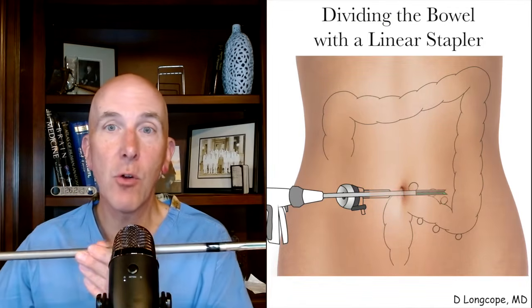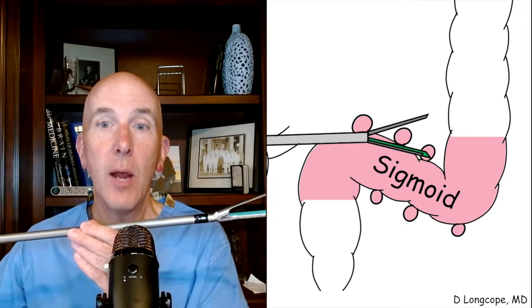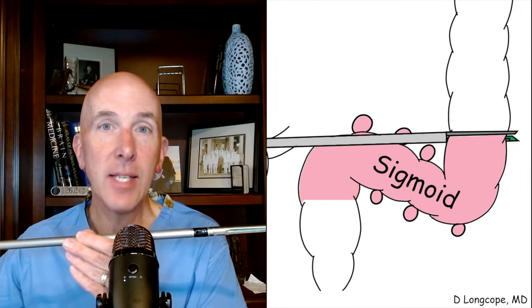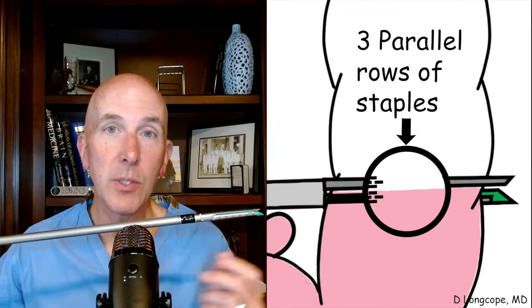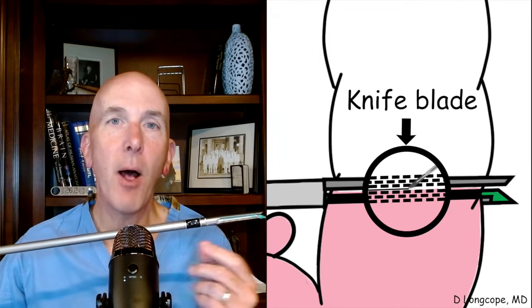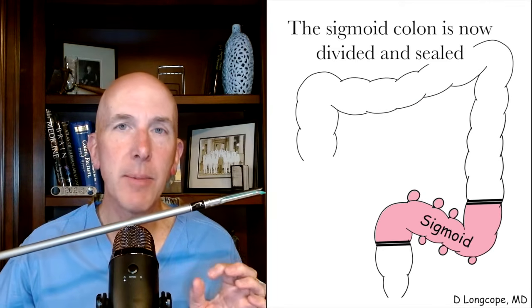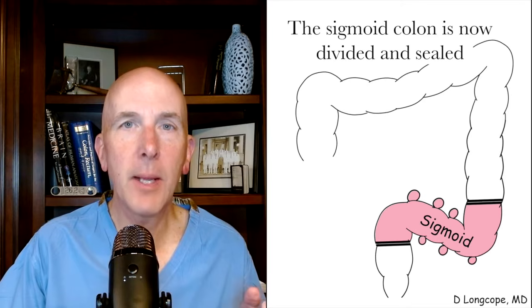It can fit through that trocar, and these jaws open. And once you're through there, you put the bowel in the jaw, you close it down, and this actually fires rows of staples and has a knife blade that cuts the bowel between those staples, so it's sealed and then divided all at the same time. Again, incredibly amazing instrument that we get to use in the operating room.